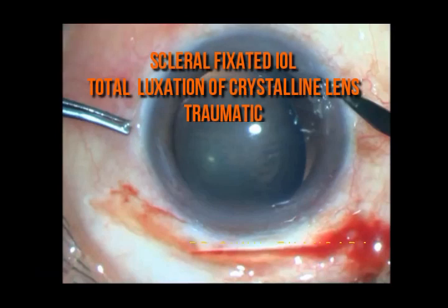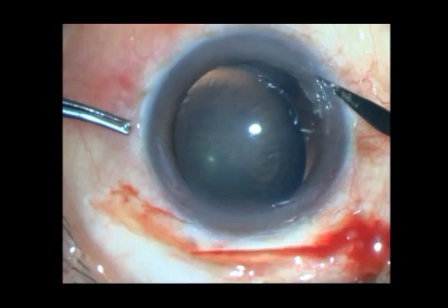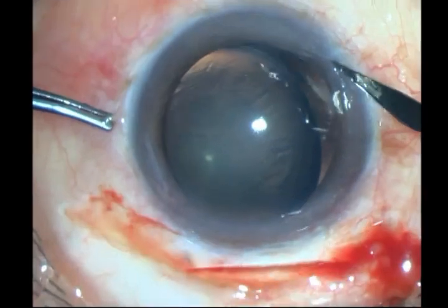This is an extremely difficult case of a completely dislocated traumatic lens. You can see the lens is tilted with no zonular support at all, and I have decided to go ahead and perform a scleral fixated IOL fixation.